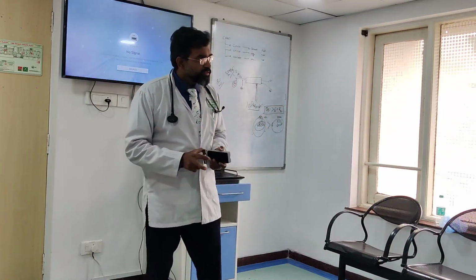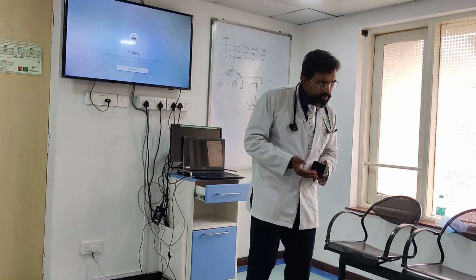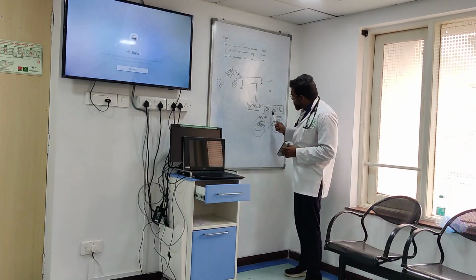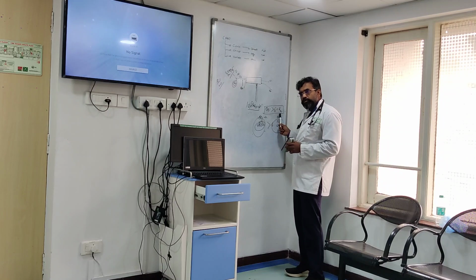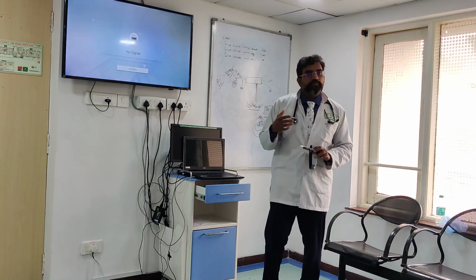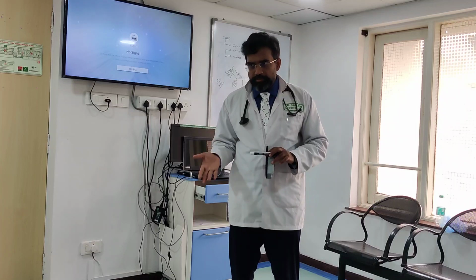Are you understanding what I am saying? So, in a modality where we are going to use convection, there is hemofiltration. I want to keep my blood pump flow 6 times of the replacement flow, more than 6 times of the replacement flow. Clear? Why am I doing this? To prevent my filter from clotting and my efficiency of the filter from going down.